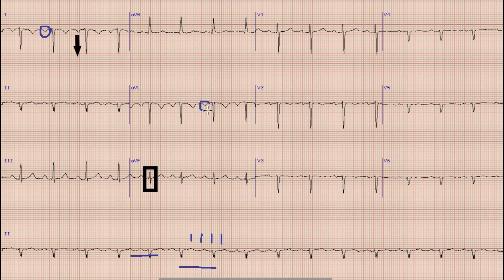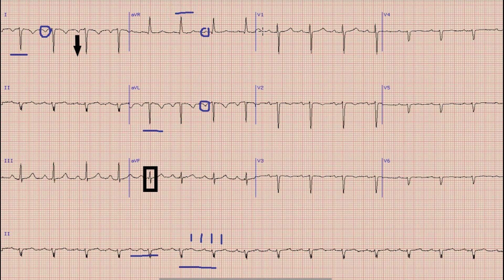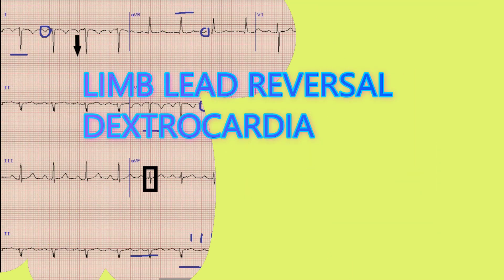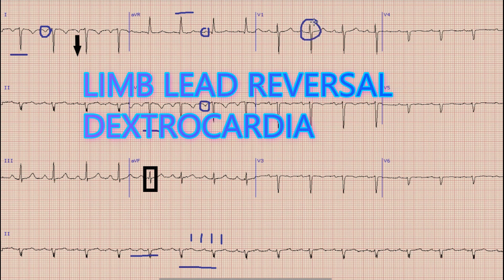If you notice lead 1 and lead AVL, the P waves are inverted, while P waves are upright in lead AVR. Similarly, the R wave in lead 1 and AVL is negative while it is positive in AVR. In normal circumstances, the P wave in lead 1 and AVL is upright and negative in AVR, and the QRS complex in lead 1 and AVL are positive. So when you look at this ECG, there are two differential diagnoses: limb lead reversal and dextrocardia.